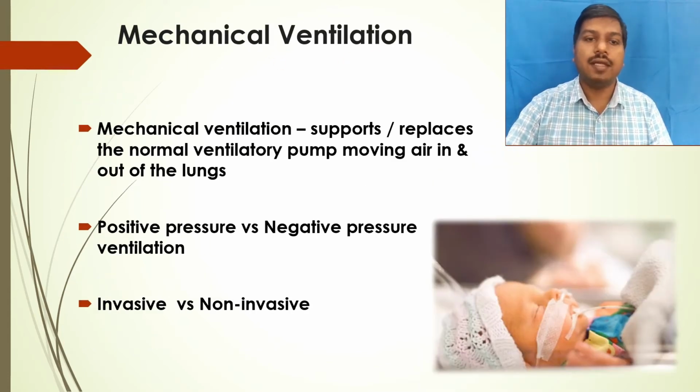So mechanical ventilation is to support or replace the normal ventilatory pump moving air in and out of the lungs. It can be broadly divided into positive pressure ventilation and negative pressure ventilation. Our normal respiration is negative pressure ventilation, and it can be either invasive or non-invasive mechanical ventilation.